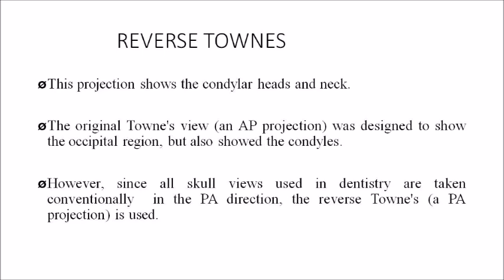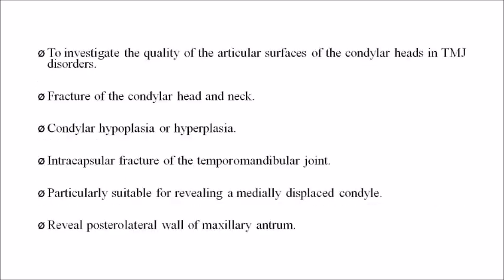The next extraoral projection is the Reverse Towne's technique, used to show fractures of the condylar head and neck region. The normal Towne's view is the AP projection, mainly for the occipital region and condylar head and neck region. The indications of the Reverse Towne's technique include investigating the articular surface of the condylar head, TMJ disorders, fractures of the condylar head and neck, condylar hyperplasia, intracapsular fractures of the TMJ, medially displaced condyle, and to reveal the posterior lateral wall of the maxillary antrum.